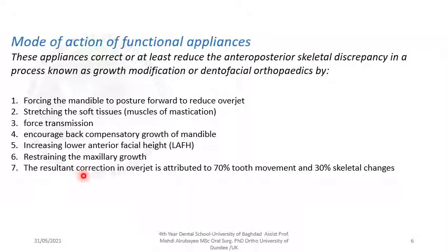Mode of action of functional appliances. These appliances correct or reduce the anteroposterior jaw relationship in a process known as growth modification or dentofacial orthopedics. This is achieved by forcing the mandible to posture forward, stretching the soft tissue, that are the muscles of mastication, forcing force transmission.